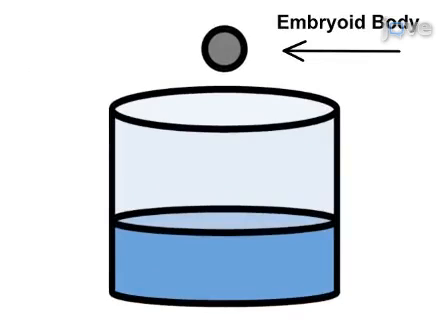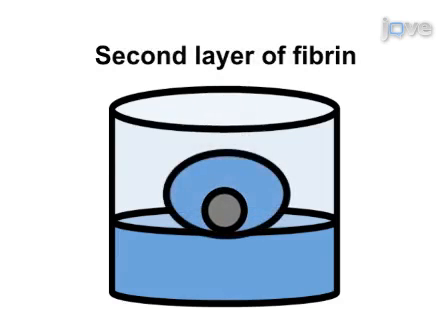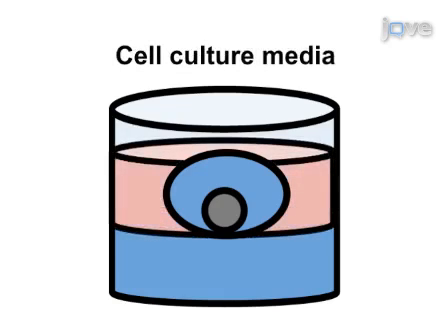Following seeding, a second layer of fibrin is added to complete encapsulation. The final step of the procedure is to add the appropriate cell culture media to the scaffolds depending on the application.